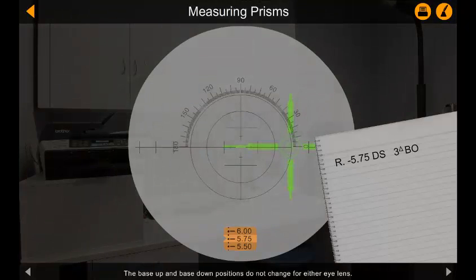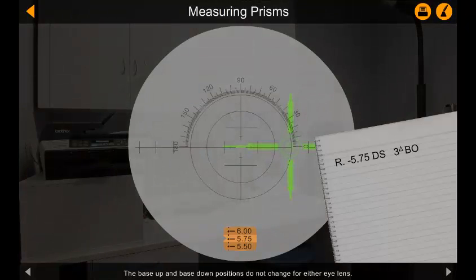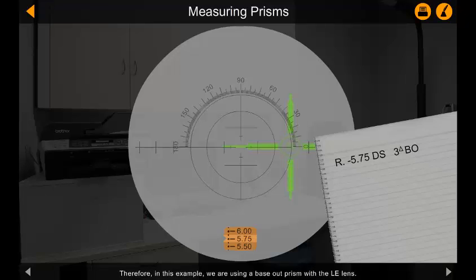The base up and base down positions do not change for either eye lens. Therefore, in this example we are using a base out prism with the left eye lens, hence the green corona is displaced outwards. Measure the left eye lens and record your final prescription.